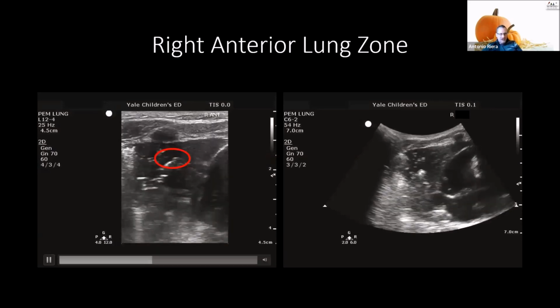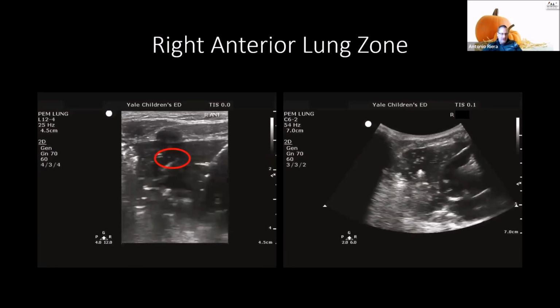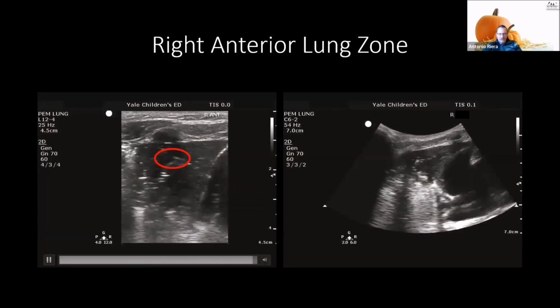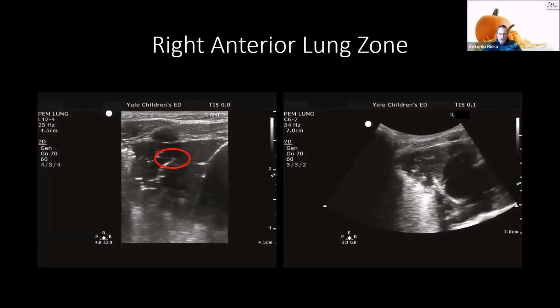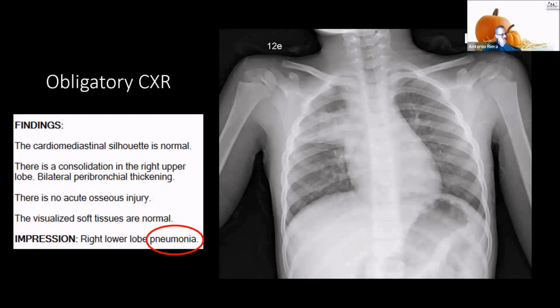And so I had the time in this particular moment to do a lung ultrasound, and look what I found. I found something pretty substantial, a fluid-filled bronchogram right there, right abutting the heart, in the right anterior lung zone. A little bit of shred sign, some air bronchograms. And so we got an x-ray to follow this up, and it was read as pneumonia. I got the chest x-ray, which I don't always do, but in this case I did end up getting the imaging study.